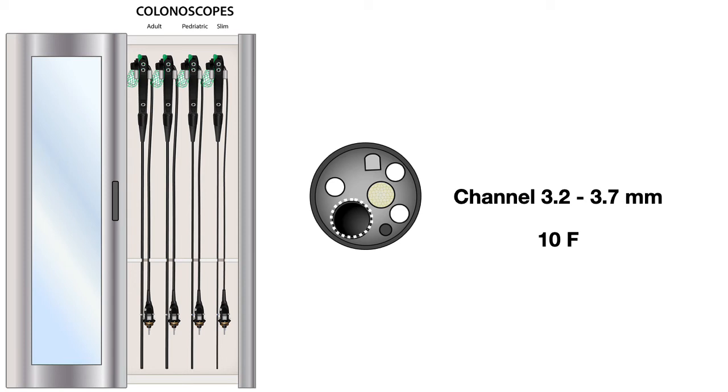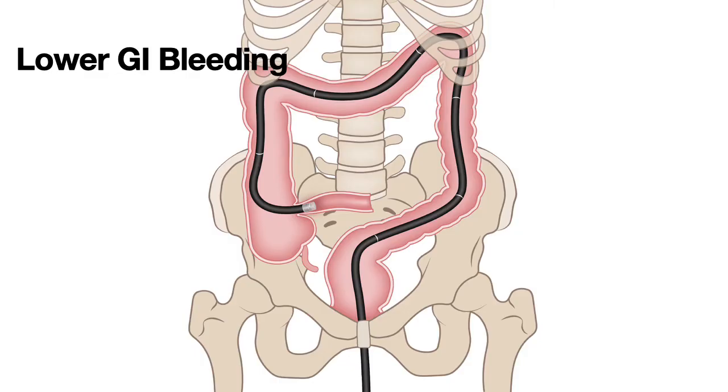When it comes to doing the colonoscopy, don't stop short in the cecum. Make an attempt to go into the terminal ileum so that you could see if the terminal ileum is clear. If it is clear and all you see is blood in the colon, you know that the source of bleeding is just coming from the colon.